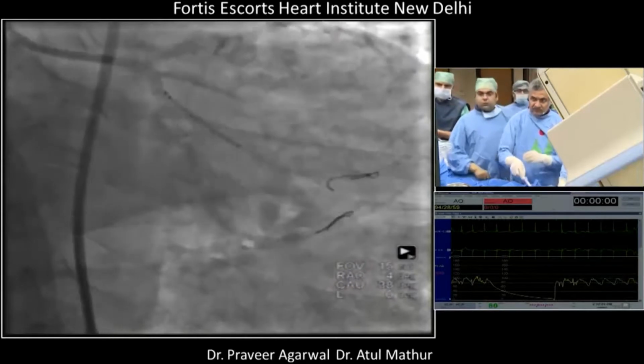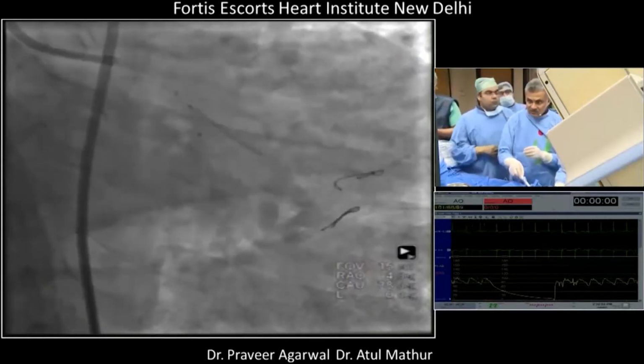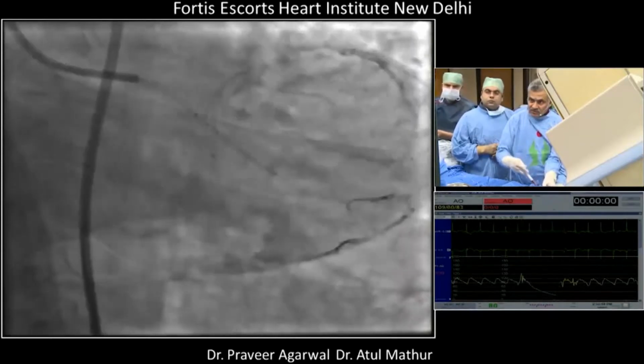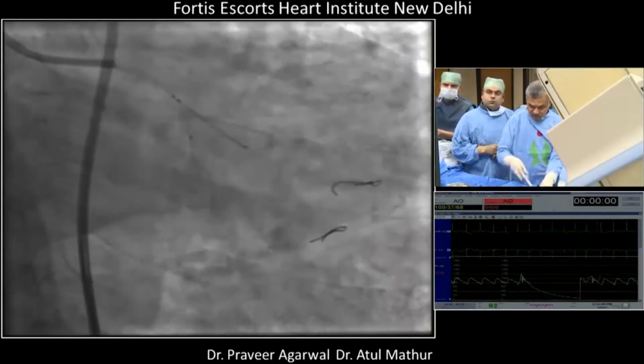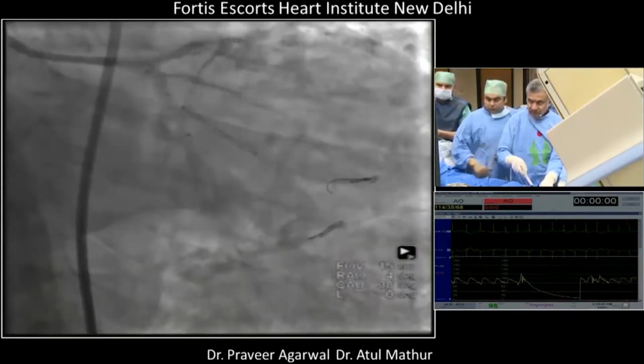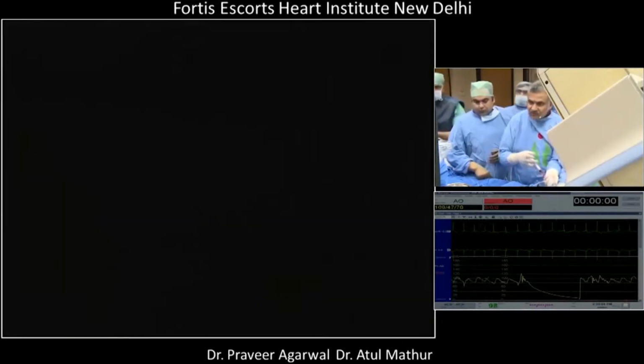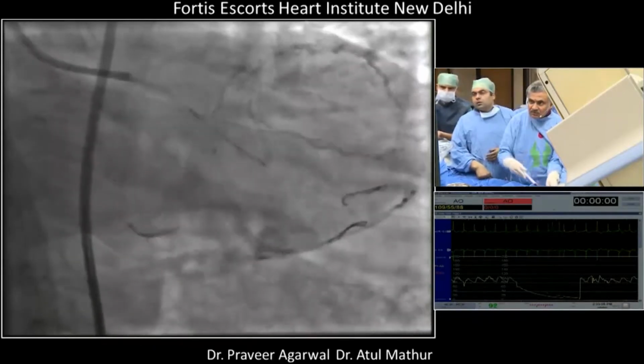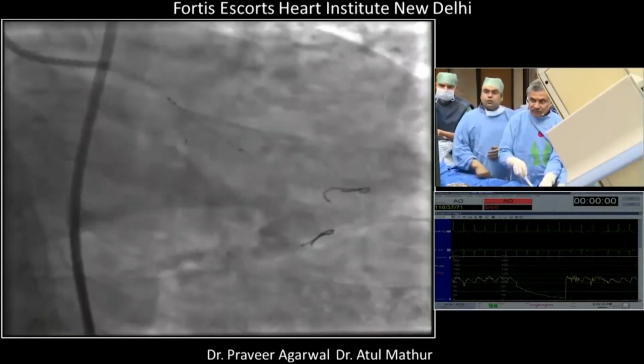Sister, fluid there, fast. Okay, good. Check please. That's it. One more shot and then we'll go up with our stent. Are you happy? Yep, I'm happy. If everybody's happy, go up with the stent.